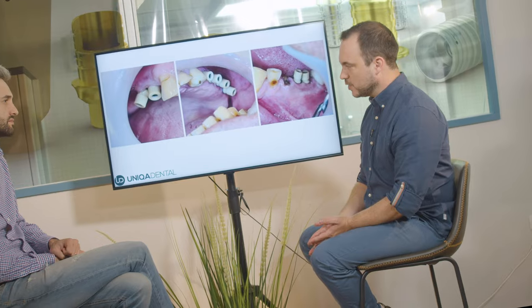The implants are very close to one another. You can't just fit this kind of scan abutments — you'll have the same problem with transfers. The small diameter of the screw channel means you can close it quite well.